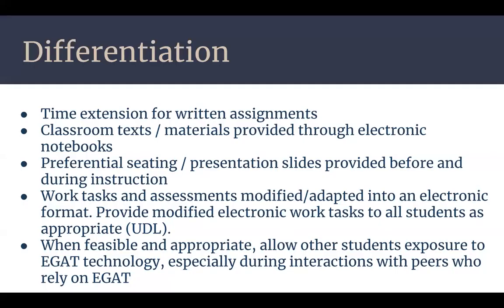So the eye gaze device, as we said before, can vastly open up options and opportunities for interaction in a classroom, for engagement and access with instructional content. What could differentiation look like to fully engage students in an equitable and appropriate manner?